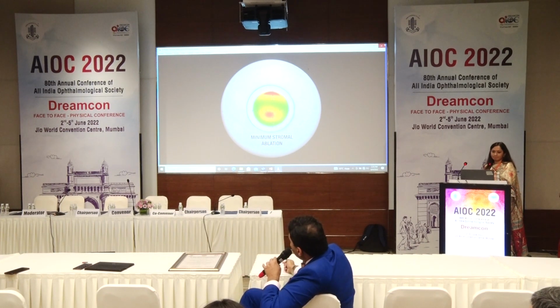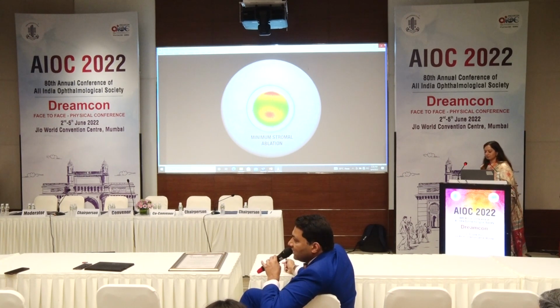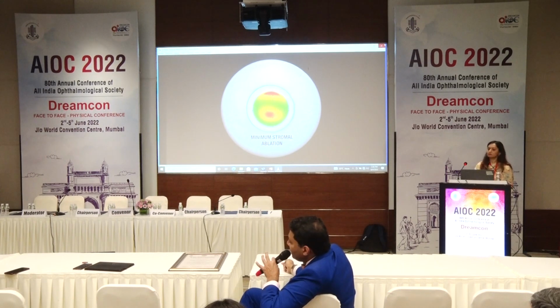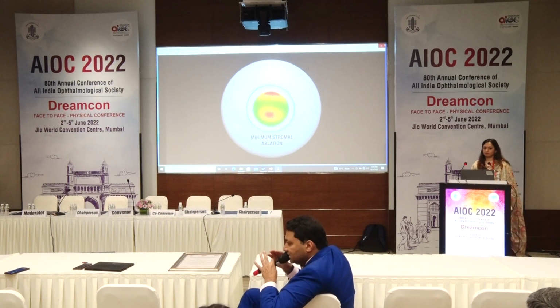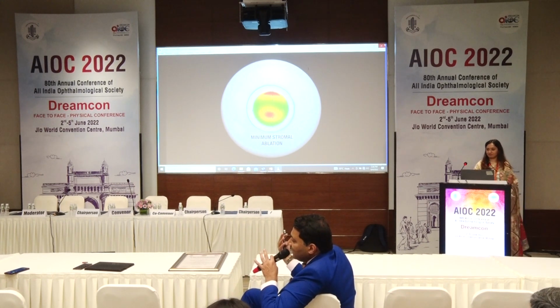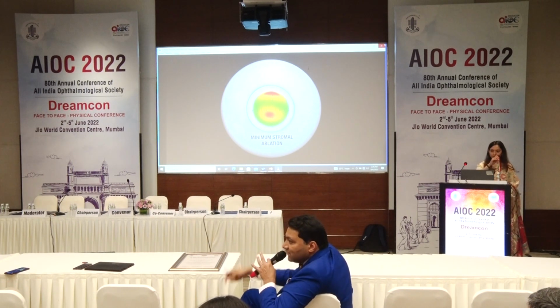So you still can do it with whatever machines. Even Zeiss, you can do it if you have a more central cone. That means if you have a central cone and you don't want the patient to undergo a full-blown laser, then this procedure can be adapted, and trust me, it will give you extremely good quality of vision difference, better contact lens fit, and more referrals to you in your practice, because patients suddenly feel that you're not doing cross-linking only like other places.